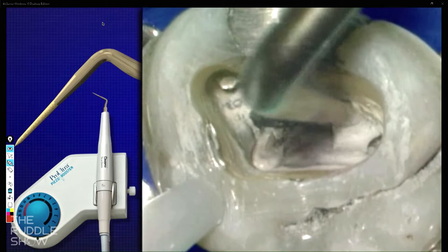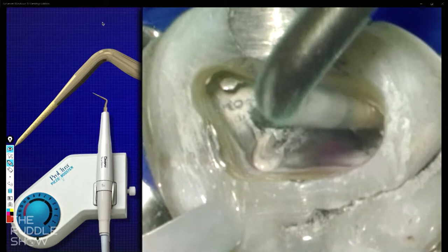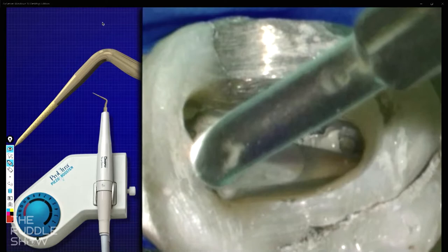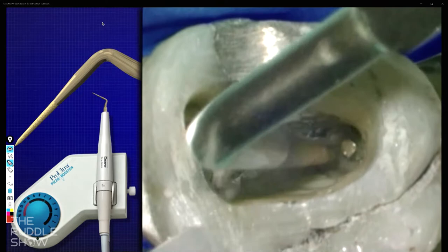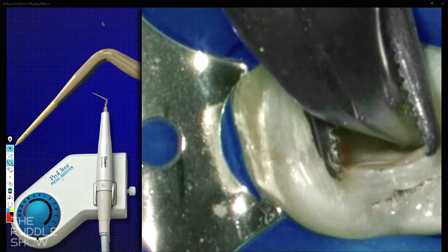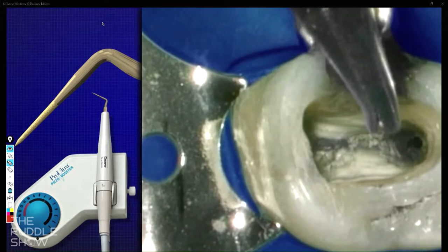And as you begin to expose the MB, the DB, you can now work between the axial wall and the silver point. But if your instrument's profile is a little bit too big, it's okay to go to a smaller instrument that can fit into the space between the silver point and the axial wall. And that's what we're going to be doing here, just right here. So we switch tips. It's a more appropriate size tip. I can get a little bit deeper. And we want to completely eliminate all the buildup from the pulp chamber and have the silver points visually identified.